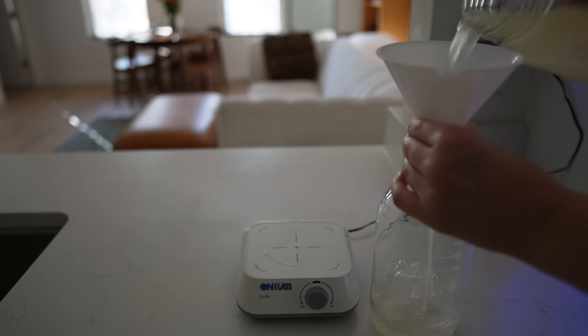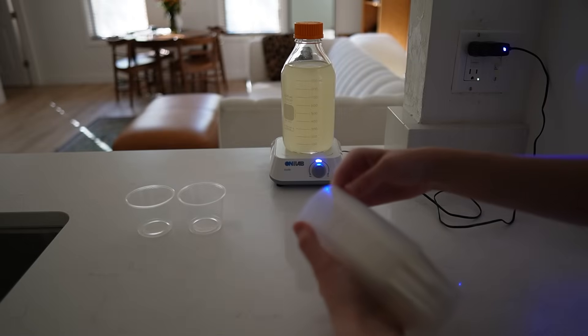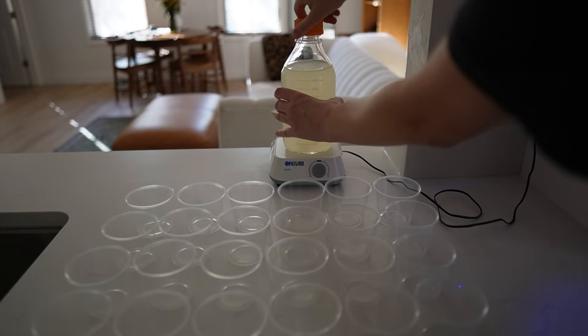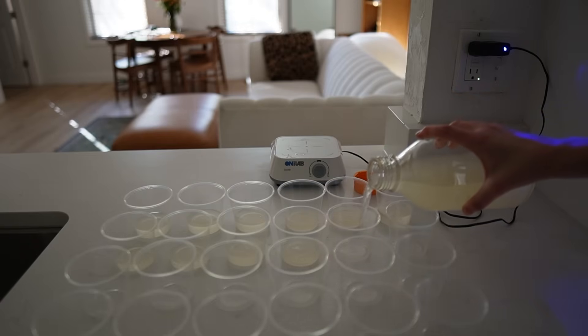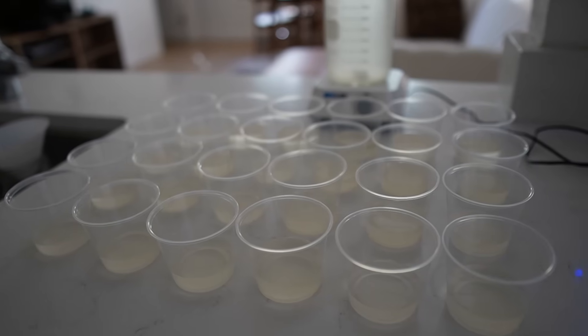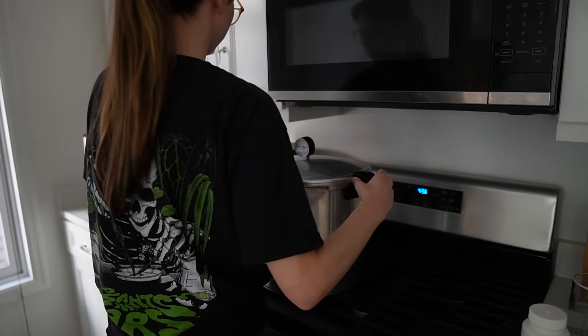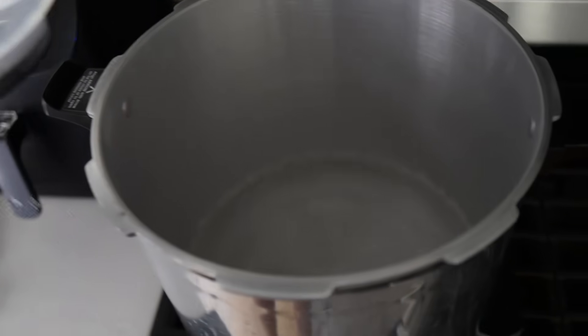Now we're ready to pour the media into the individual containers. These containers need to be made of polypropylene, or PP, to be able to withstand the pressure cooker, which is going to max out around 121 degrees Celsius. The purpose of autoclaving is to kill any bacteria that could be in the media — we need it to be very, very clean. I start the sterilization process by adding 12 cups of water to my pressure cooker.